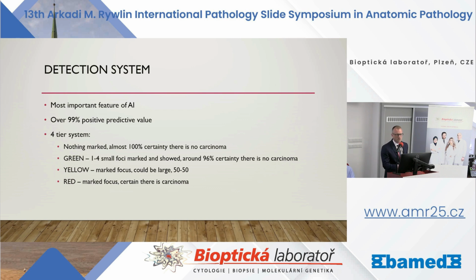It gives you probability and shows you foci, small and large, and the probability of carcinoma from the most benign green to mostly carcinoma red.